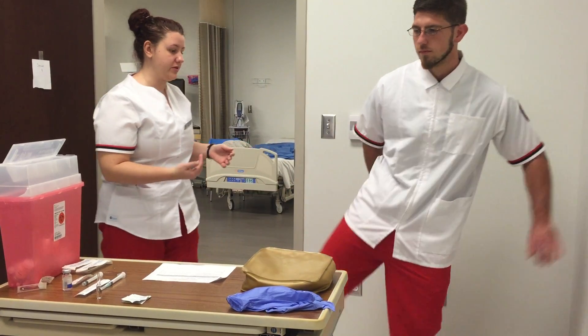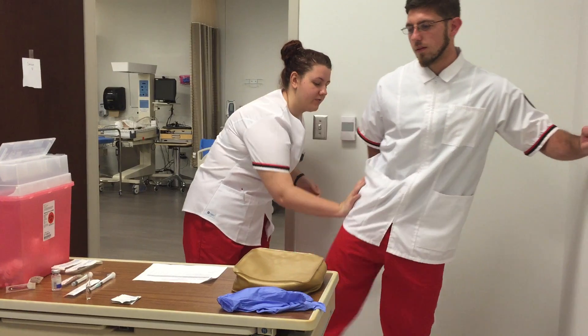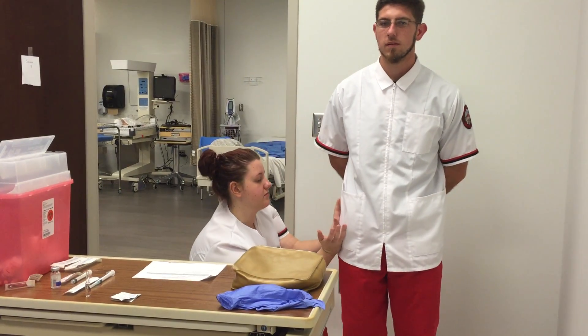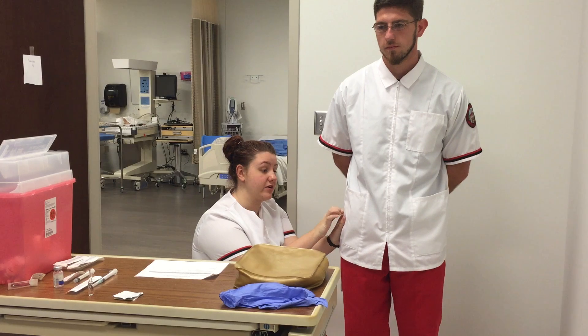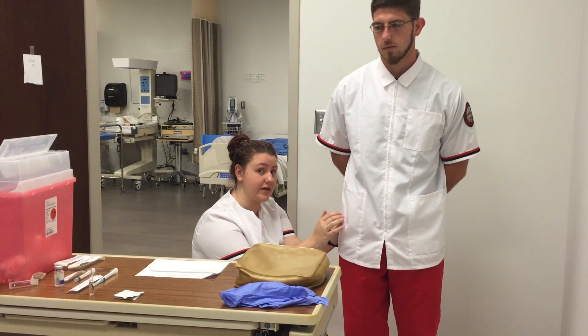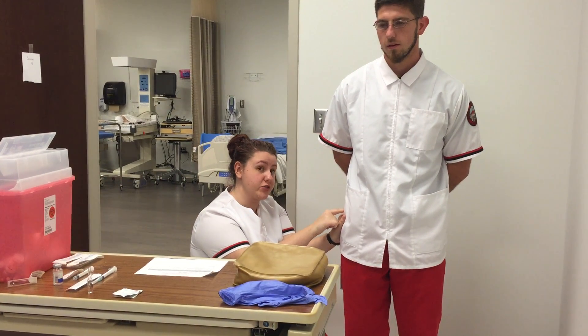Can you bend your leg towards me again? Thank you. I'm placing my hand here and using my non-dominant hand, I would give my injection right here — careful to avoid the iliac crest. This is the ventral gluteal site.